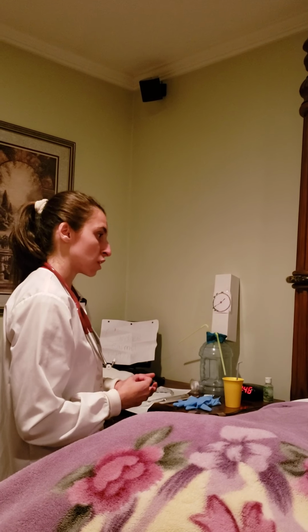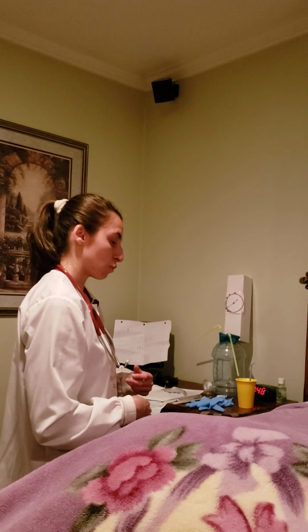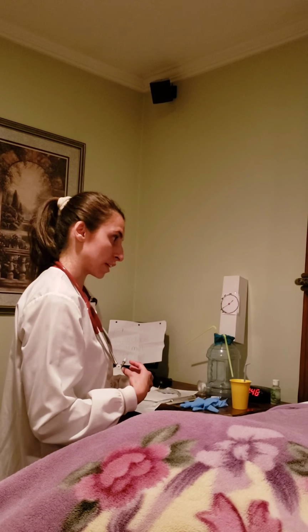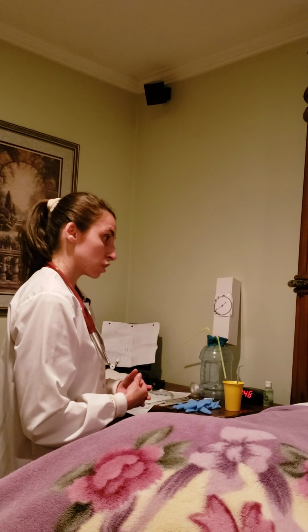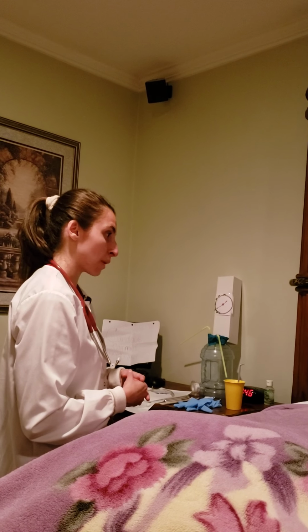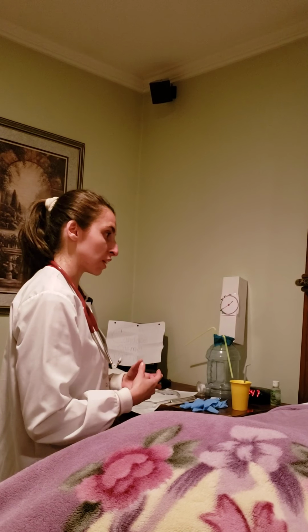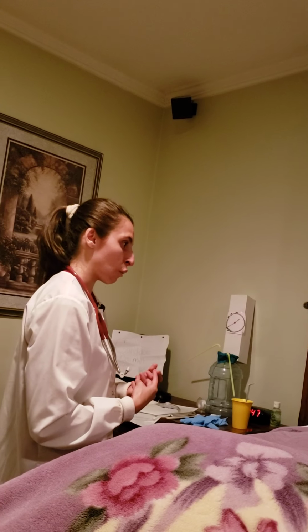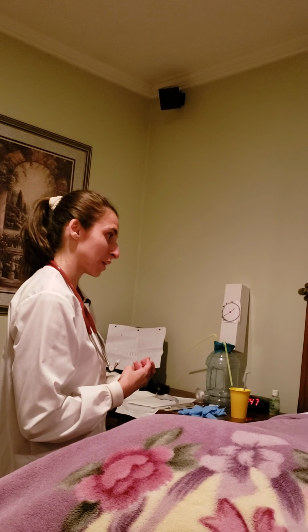And the other complication is aspiration. So the NG tube is going to pass through your respiratory system before it gets to your stomach, and when the gastric secretions are being removed, it sometimes could leak out into your lungs, and that can cause aspiration. So preventions of this would be, I would elevate the head of your bed to about 90 degrees when I am feeding your medications or when you are eating. And after you're done eating, I will have you remain in that position for at least an hour. Any other questions? How long will this be in me?